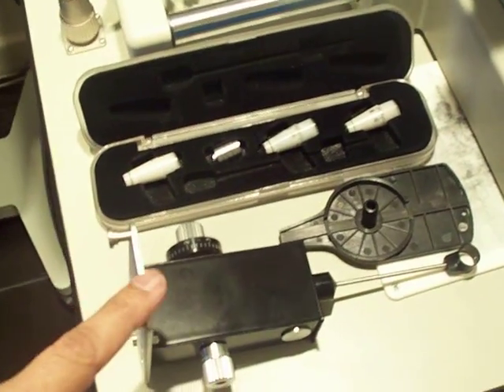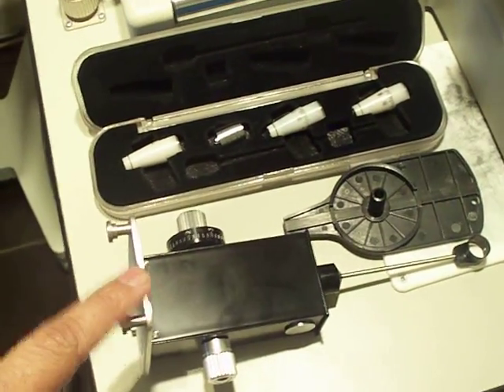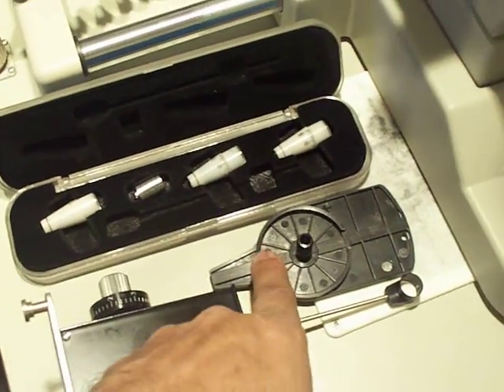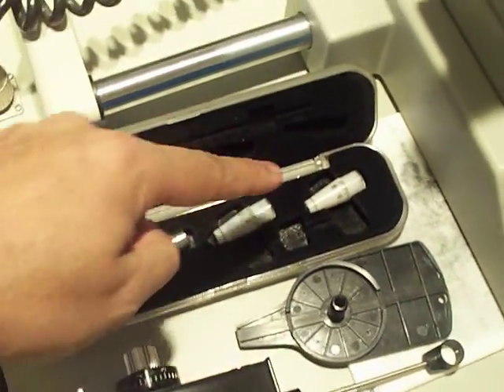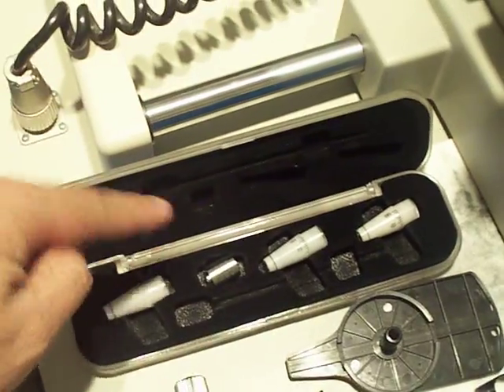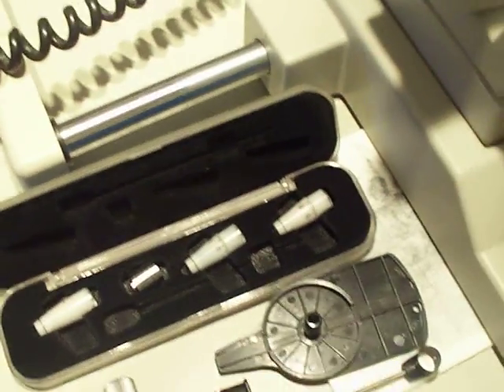In your pack you should have the Goldman tonometer, black resting plate, three prisms and a calibration weight.